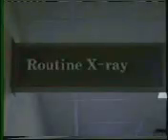Defibrillation was once considered an advanced skill that was performed only by critical care nurses and physicians who were specially trained in rhythm recognition. Now, the widespread use of automated external defibrillation, or AED, has made early defibrillation by personnel with basic life support training possible. The availability of these AEDs and the simplicity of operation has greatly increased the number of personnel who can provide defibrillation, and this has shortened the critical time between collapse and defibrillation.